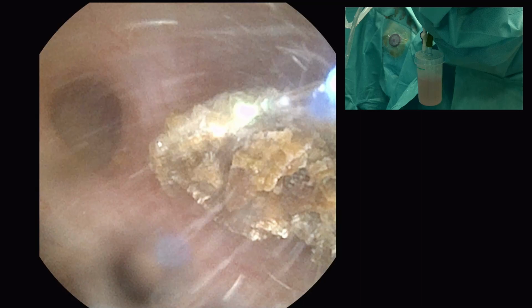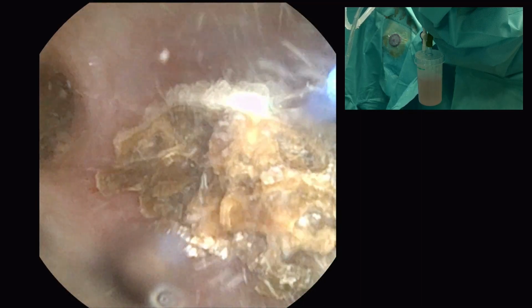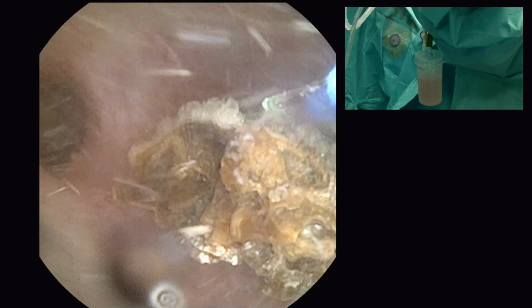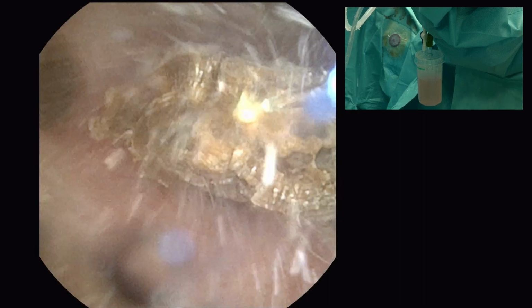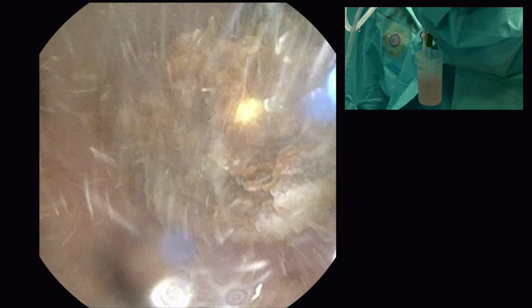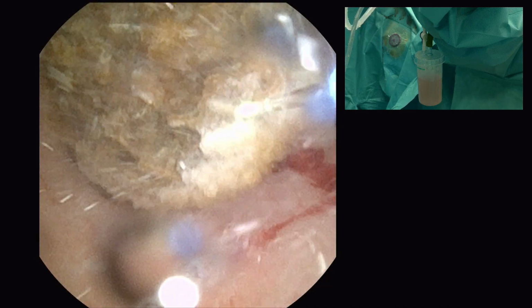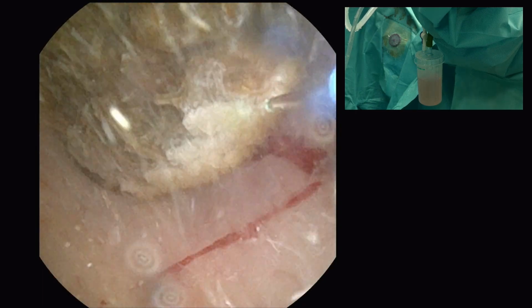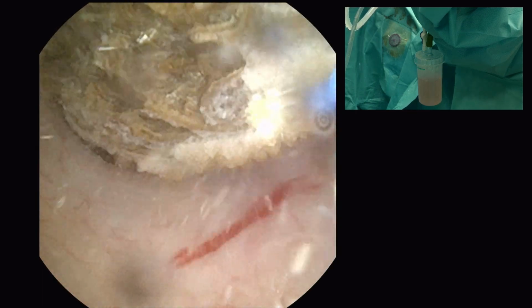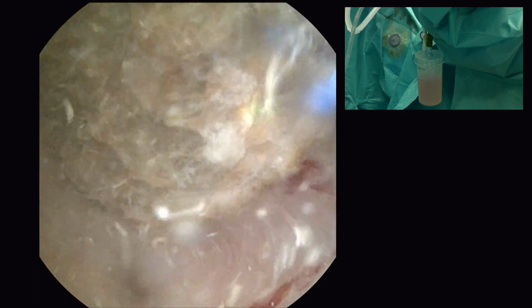Do you complete this procedure, Dr. Sajad, with the double J stent at the end of the day? Yes, sir. Always. I am always a very safe surgeon. I don't want to take any chances. I always stent the patients before and after, and remove it after 2 weeks. If you see a lot of fragmentation or dusting with the stent, then I will remove it at the end of 4 weeks. But usually we go for 2 weeks only. 2 weeks prepare, 2 weeks back.